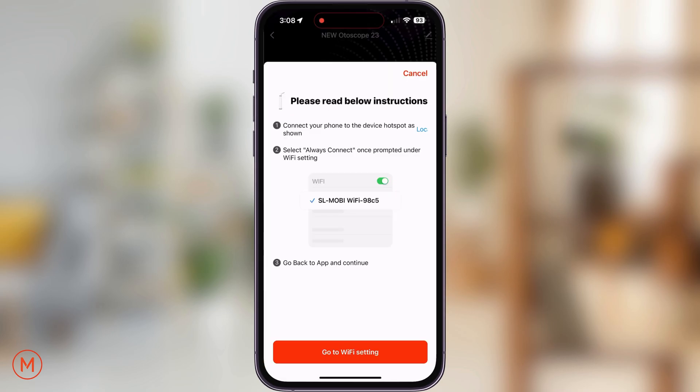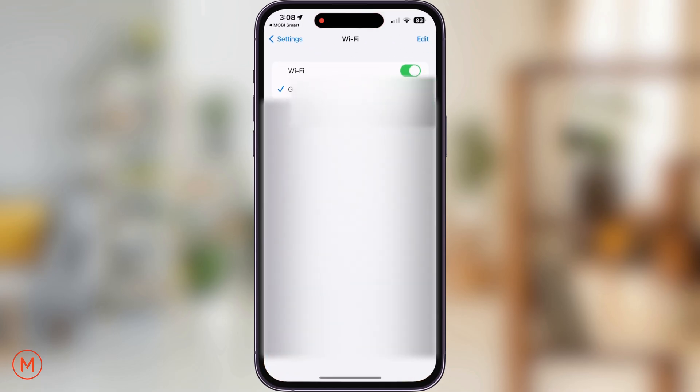After scanning the QR code, tap on go to Wi-Fi settings at the bottom of the screen. By doing so, the app will take you to your smartphone's Wi-Fi settings, where we will look for and connect to SL Mobi. After connecting, if your smartphone says no internet connection or connected without internet, that's the indicator that we have successfully connected to the Autoscope's hotspot connection.